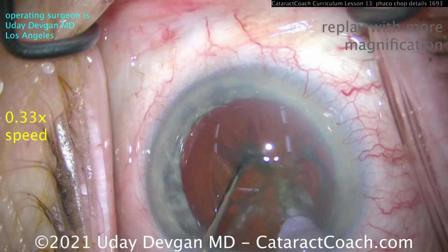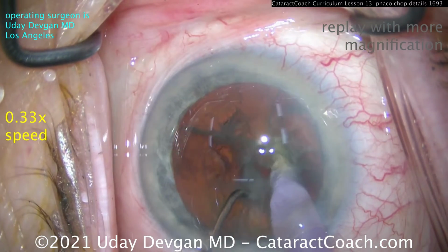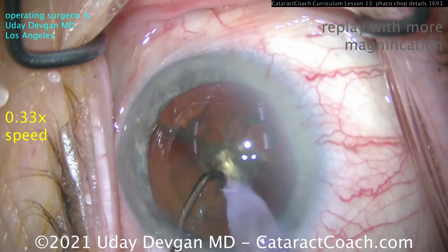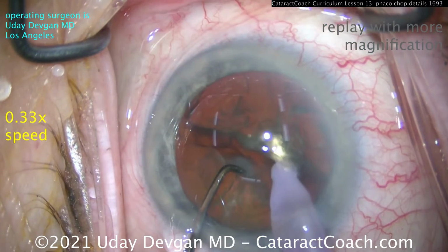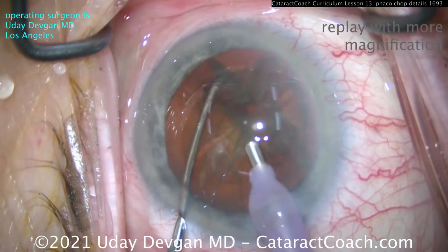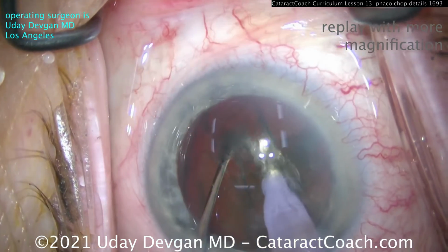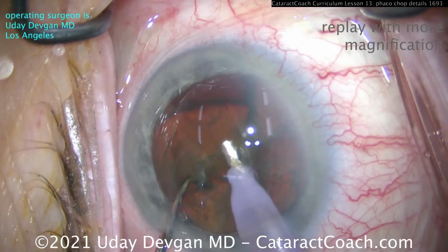Look, we pushed the phaco probe in, the chopper's pushed in, two instruments are brought together, and there we split it apart, and you can see two halves are achieved very nicely. A little extra separation to make sure the halves are freed from each other, and now we can go on to sub-chop the rest of the nucleus. So let's resume here in normal speed, and you can see it's very easy to do this technique again, pushing the chopper right into the nucleus, split that, and there we go, you have quadrants.